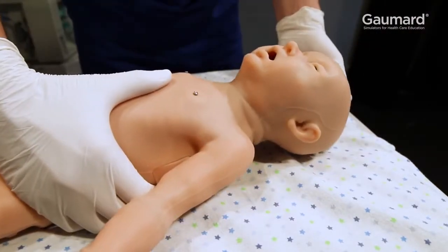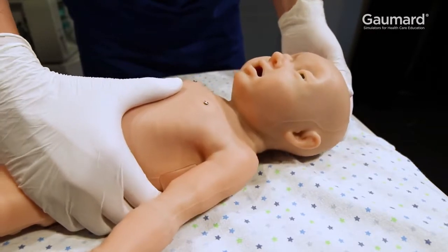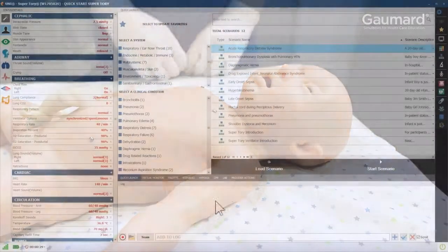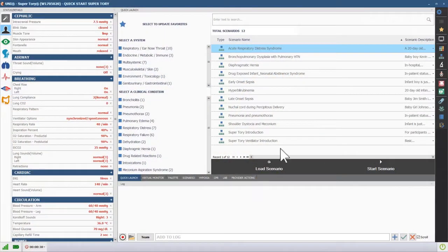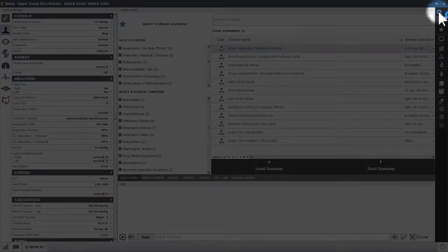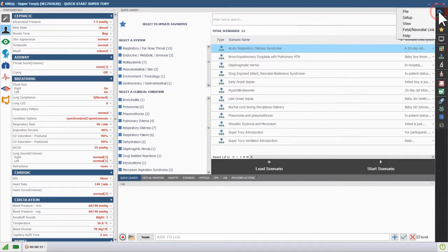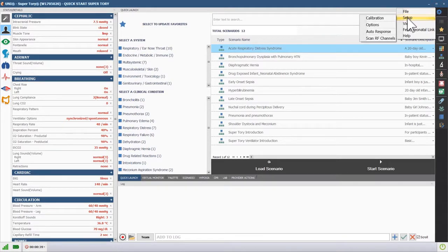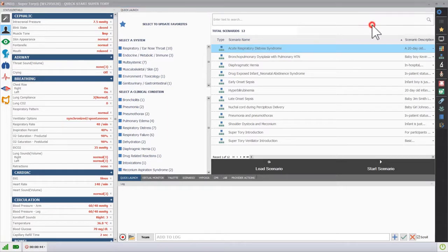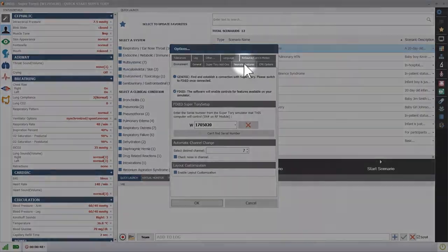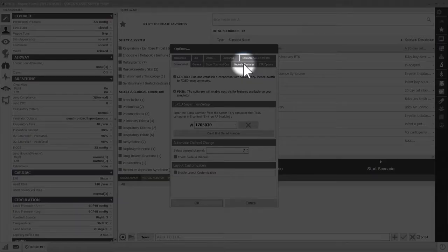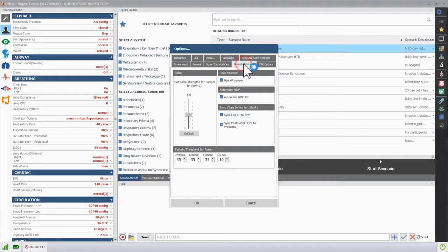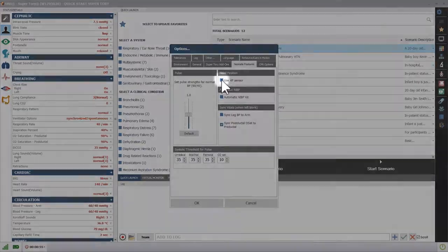Supratory can automatically detect incorrect head and neck position and obstruct the airway as a result. To use automatic detection, the head position sensor must be enabled. Click the menu icon in the upper right, scroll over Setup, click Options, open the Neonate Features tab, and click the button next to Use HP Sensor.